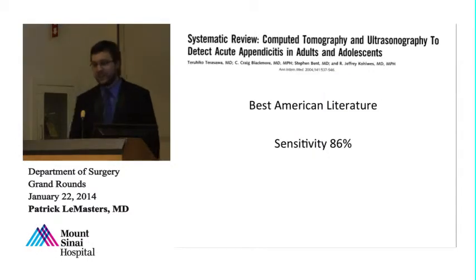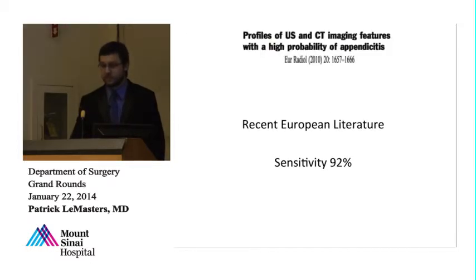So looking over the literature, you can look at the review of the best American literature for appendicitis, showing a sensitivity of about 86%. Comparing this to recent European literature, showing a sensitivity of 92%. This is performed by radiologists.